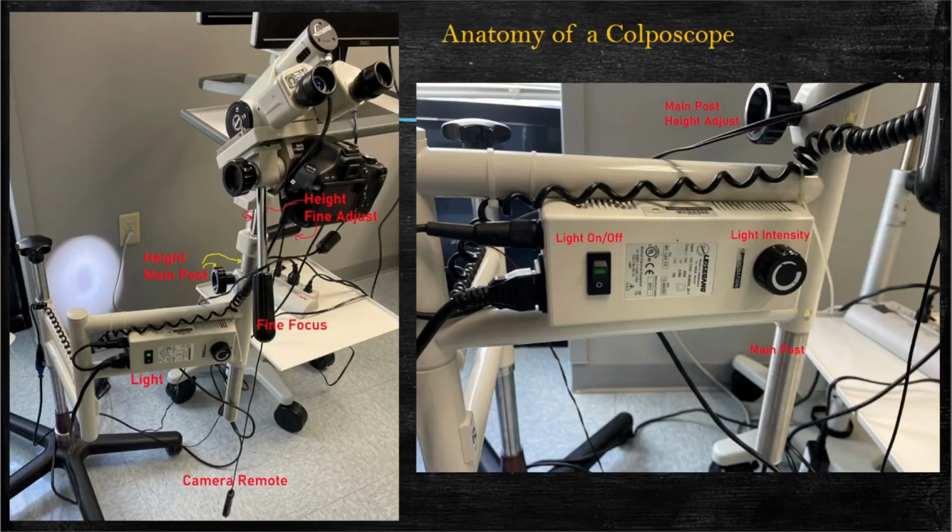So this is our colposcope, and we've got a camera attached here that we're able to take pictures with. But the main parts of it, this is the light control down here. So we've got a switch to turn the light on and off, and then a dimmer switch for intensity. We've got an adjustment post here for the height, which this handle here is for kind of fine height adjustment.